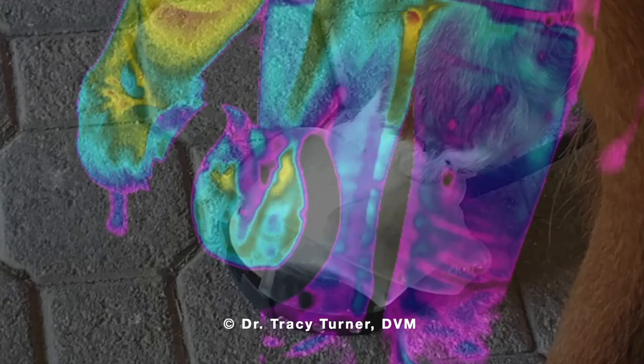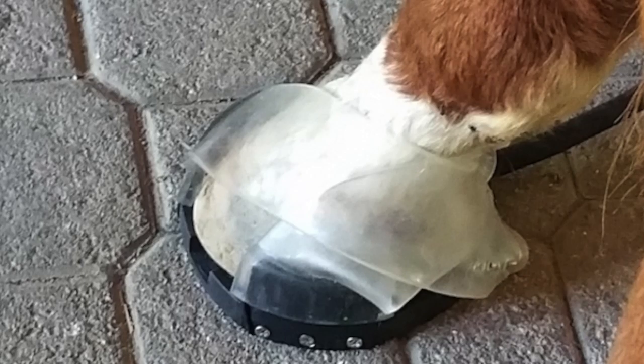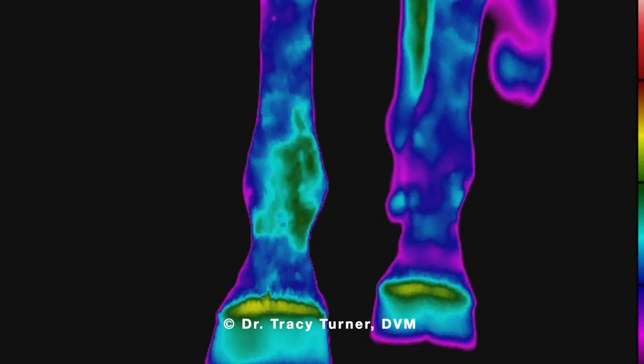In this first series of thermal images, you can see that the legs have similar temperatures looking from the front, lateral, medial, hind view, and as well as picking up the foot and looking at the sole.